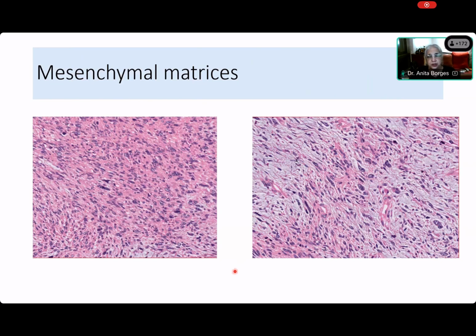Saida, it is extracellular. It's inside a lumen. It is a material. It is not cellular. So what is it? Deepali, what would we call it? Stroma. No, if it's inside a lumen, what do we call it? We call it a secretion, right?